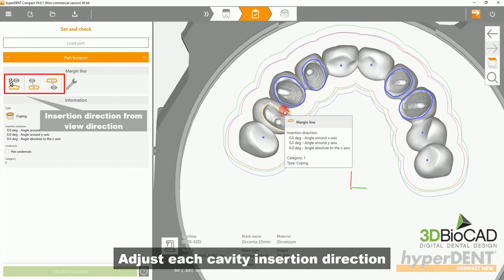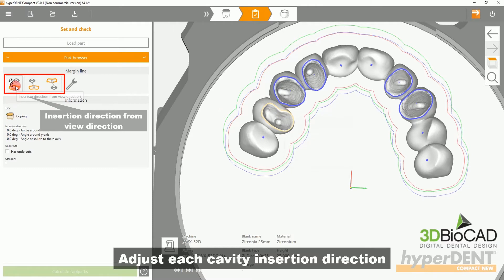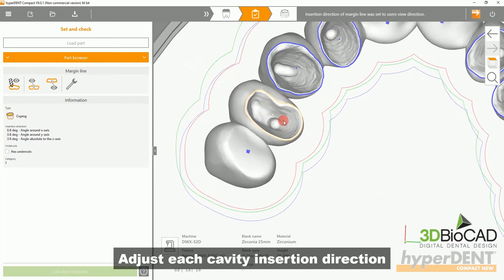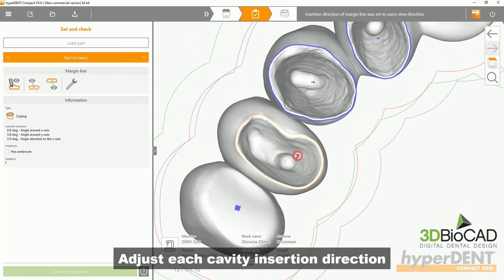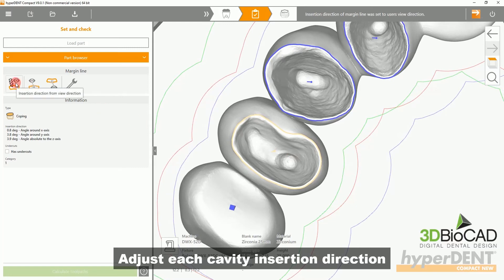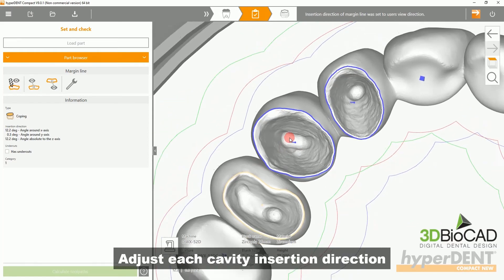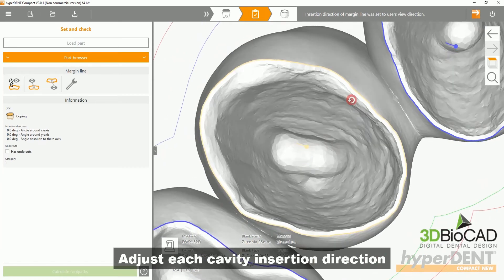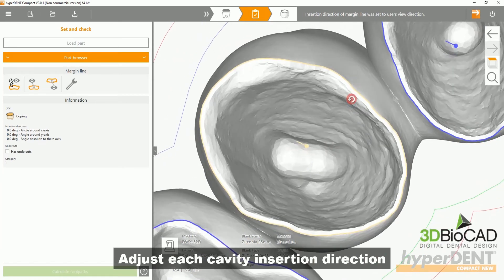Next, you will want to adjust each cavity insertion direction. You do this by selecting the margin line and selecting the bottom line, then clicking the button on the left side of the screen.